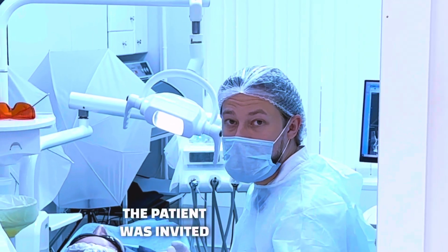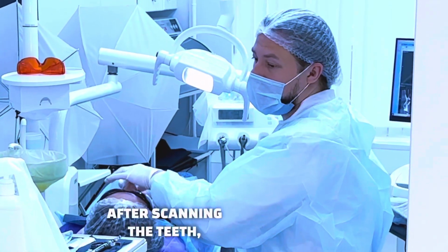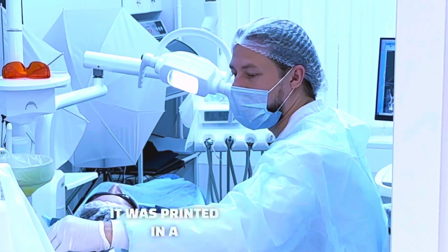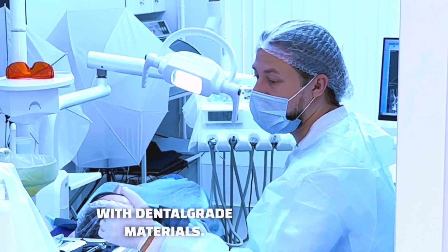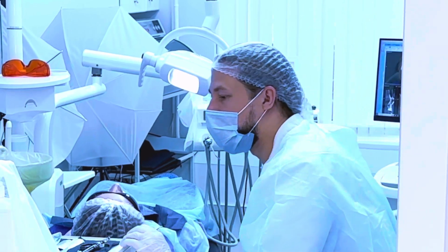The patient was invited to our clinic for preliminary scanning before implantation. After scanning the teeth, I designed the surgical template and created it. It was printed in a 3D printer with dental-grade materials. It's ready for handling and completely non-toxic.